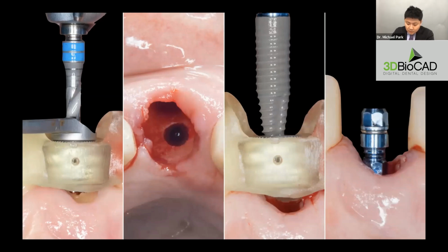And in this case, we're doing an immediate implant placement. And if you look at the second picture from the left, you can see that the osteotomy is made on the palatal slope of the socket. And if you have done freehand immediate implant placement, you'll know that it's not easy to do this osteotomy just because it is on a slope. Your drill will want to slip, but of course, with guided surgery, that's not a problem because the surgical guide is guiding our drill. So we're not worried about slipping. And we're placing our implants through the guide, so it's a fully guided surgery.